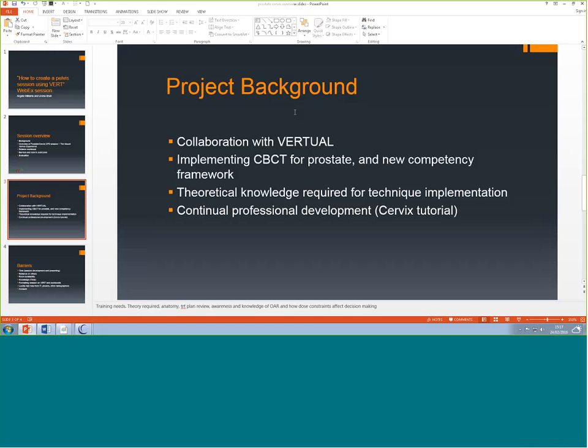There was also a lot going on with our prostate patients in terms of fiducial markers, CBCT, OBIs, and because there's such a high turnover and fluidity with the technology, we felt it was important to produce a package that would help everybody coming through the door. So we then also created the cervix one as an addition to it. Going forward, we are planning on producing some more.